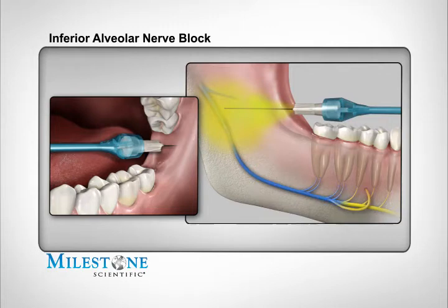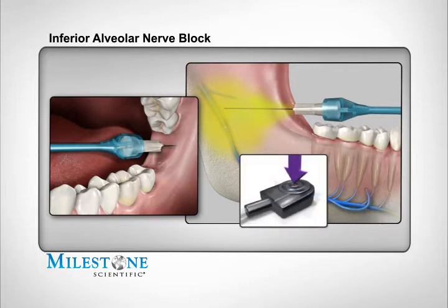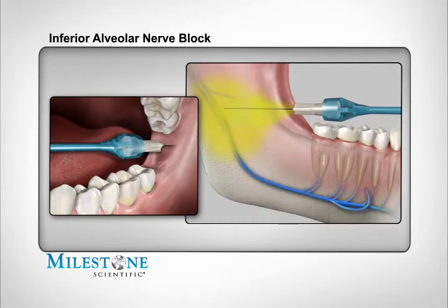It's recommended that the first 1/4 of the cartridge be dispensed using the control flow rate before transitioning to the second, faster rapid flow rate. The rapid flow rate is used during block injections only after your patient has acknowledged that they have achieved soft tissue anesthesia of the area being injected. This is acknowledged by subjective statements elicited from your patient.